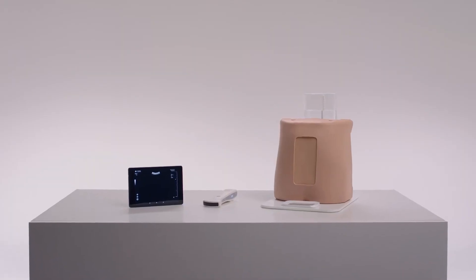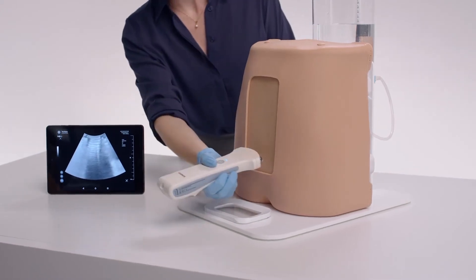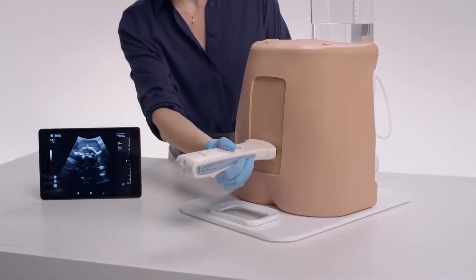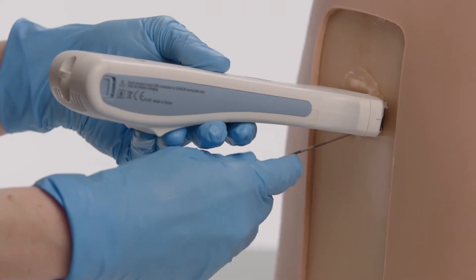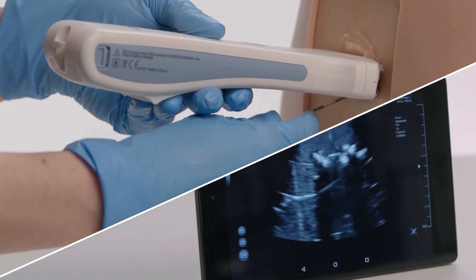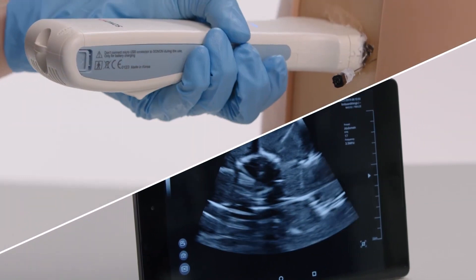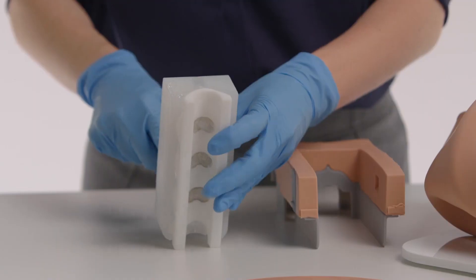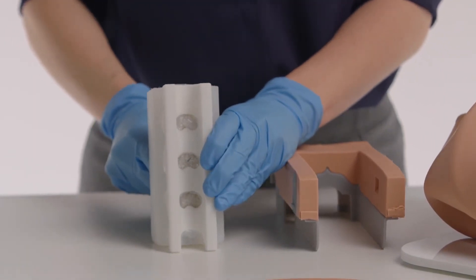The final product in the range offers ultrasound capabilities. The ultrasound insert includes visible facet joints and has been tested to work with all major ultrasound brands. The model is suitable for lumbar puncture, epidurals, spinal anesthesia, and facet joint injection training. Each model features the ability to review injection accuracy and needle positioning.